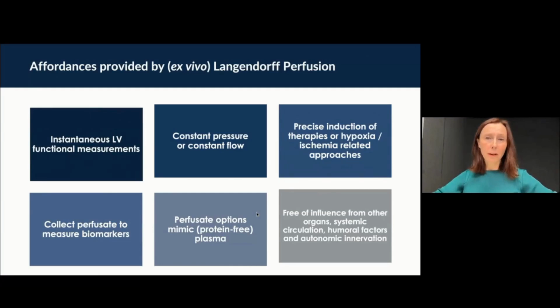So it provides me with instantaneous functional measurements. My omics approaches are what I would call a snapshot technique. So I'm getting an understanding of the biology inside the cell at the moment at which I stop everything, which I do with a drop into liquid nitrogen. So therefore, I need to be able to measure my function at that exact same moment. And there's literally maybe 2 seconds between having a balloon inside my left ventricle and that heart being submerged in liquid nitrogen for further biochemical assessment.